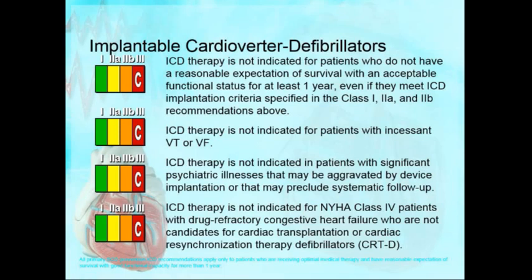The question on internal medicine boards is very simple. They trick you all the time. Call cardiology to discuss this, call EP. You may do all those things, but on a board exam, they're very straightforward. He's got problems. He does not want to be shocked. He's aware of the consequences. And you also think it may not help him. You can pull the plug. You say, I'm going to take off the ICD function. Do not say ethics consult.